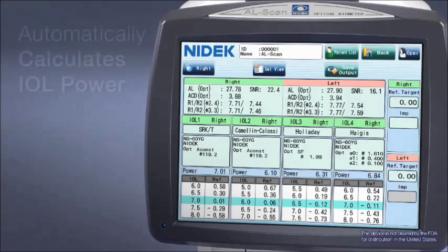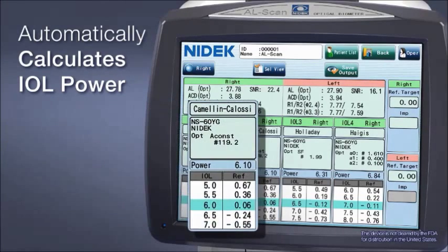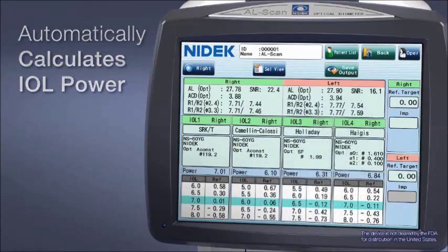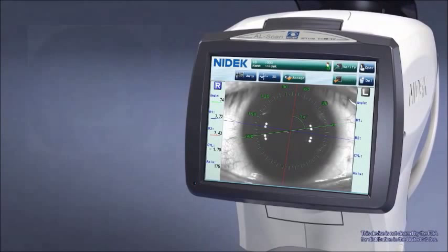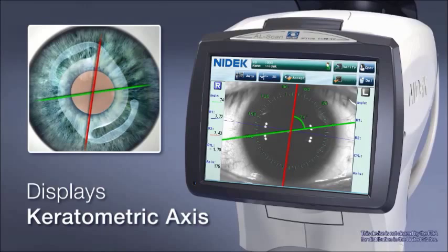The AL scan automatically calculates the optimal IOL power using its own measured data without the need for additional equipment. In addition, the keratometric axis is displayed on the eye image to assist with toric-IOL alignment.